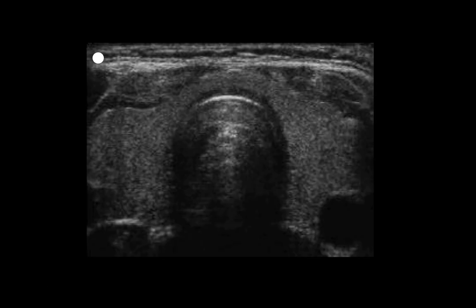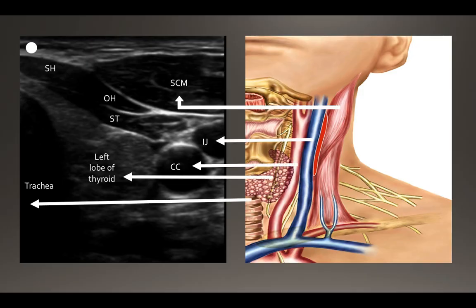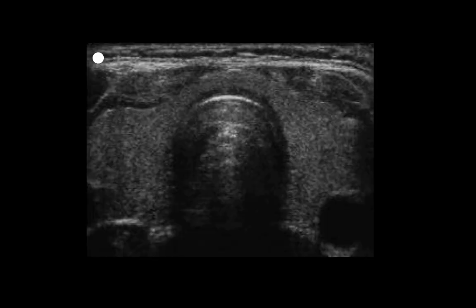Here's a more realistic look at what you might see when you scan the thyroid. If you slide just to the patient's left, here again is the anatomy: you have your trachea, the left lobe of the thyroid, your common carotid artery, internal jugular vein, and then your superficial strap muscles and the SCM. Drawing our attention back to the thyroid gland, notice how normal thyroid tissue has one homogenous echo texture. This is important because we're going to identify pathology as a change from this normally uniform medium-level echogenicity.